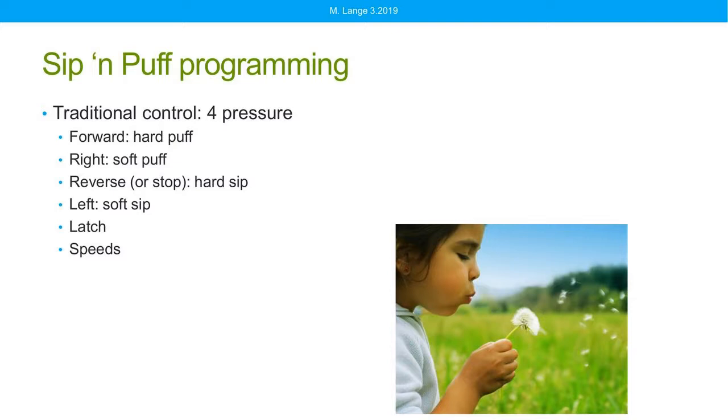It varies by the wheelchair electronic system and how it's programmed, but typically someone can give repeated hard puffs, and that will ramp up the speed for the driver.